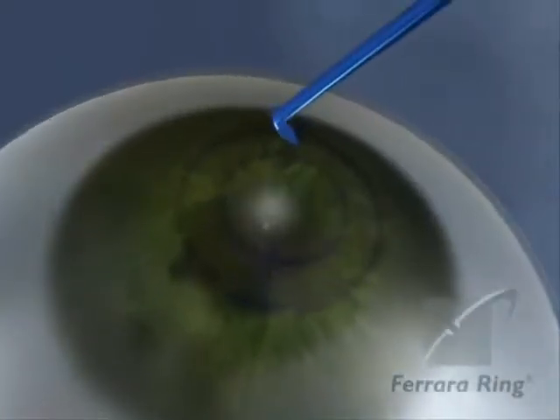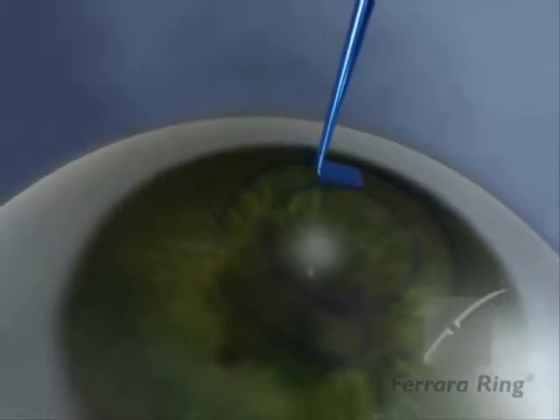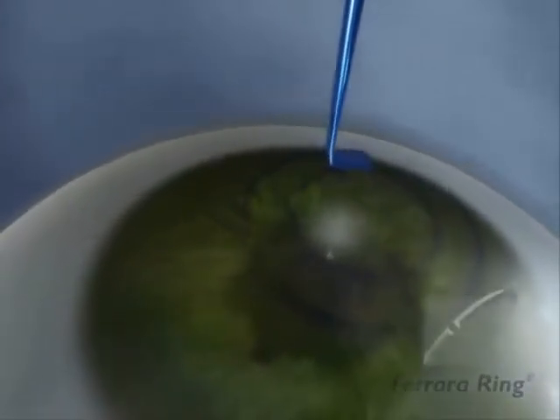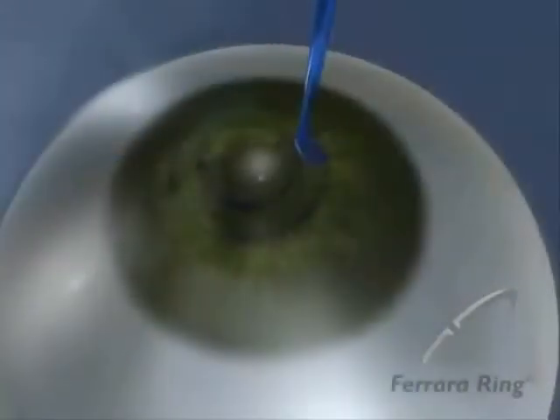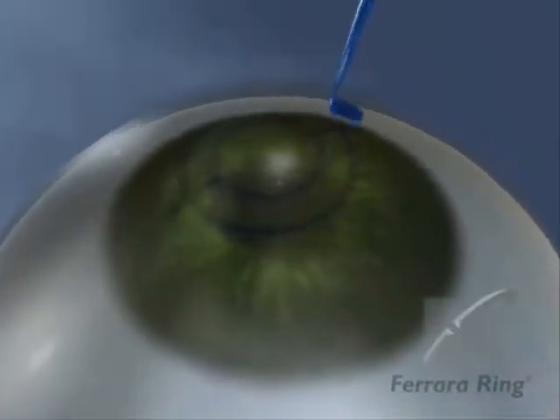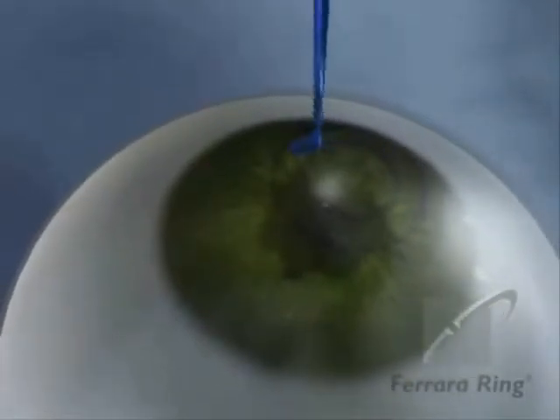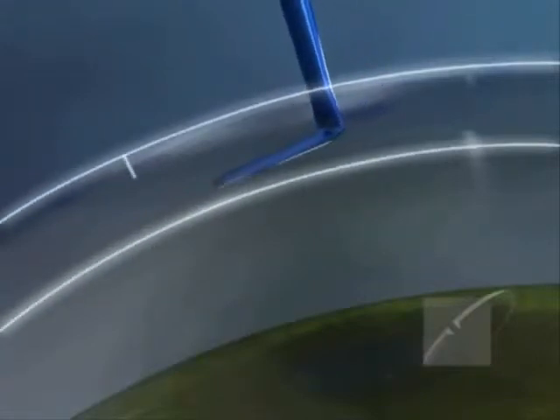Introduce the tip of the Suarez spreader into the incision, widening with small movements the pocket created in the previous step. For the implantation of the two segments, do this procedure in both directions. It's very important that the pocket be created at the proper depth, as the ideal positioning of the Ferrara ring is directly related to and dependent upon this step.